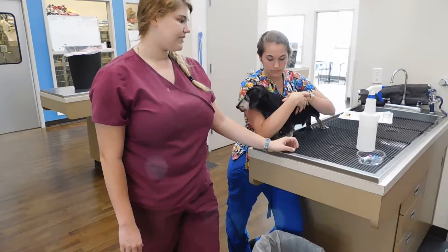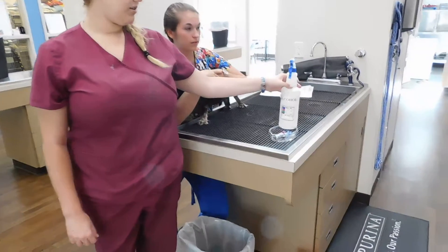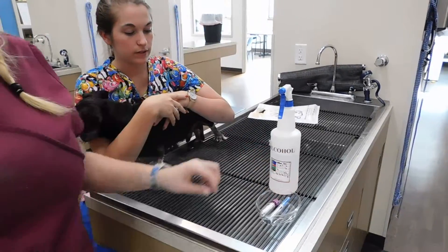This is task 18. I'm going to be doing cephalic venopuncture on a canine. Our trade supplies consist of our alcohol for prepping, our 3cc syringe with a 22 gauge needle, and then our EDTA sample collection tube.